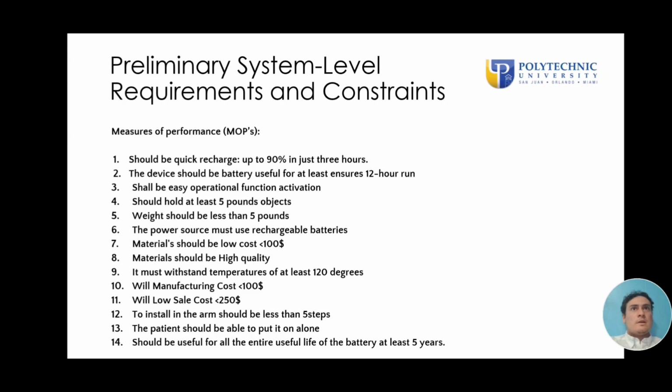Here we continue with the preliminary system level requirements and constraints with the measures of performance, or MOPs. Should quickly recharge up to 90% in just 3 hours.